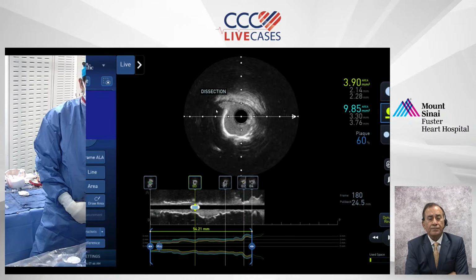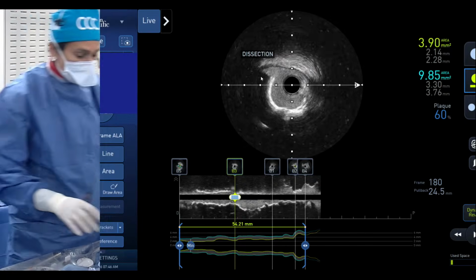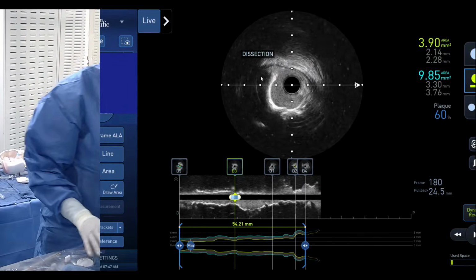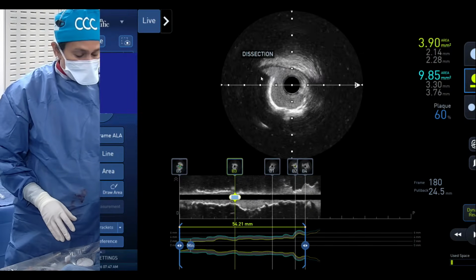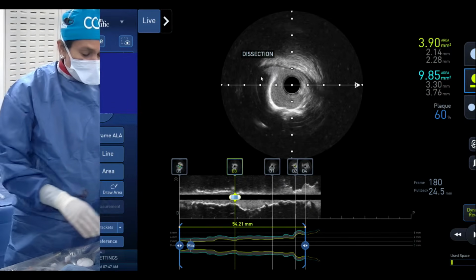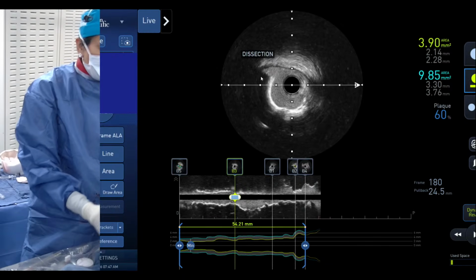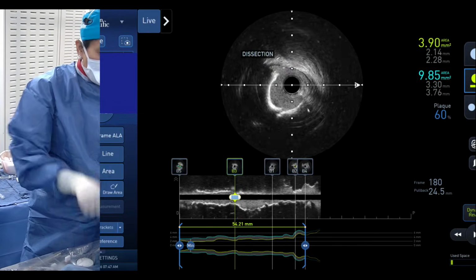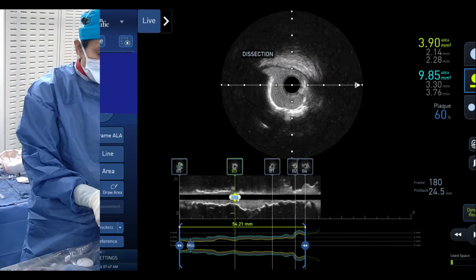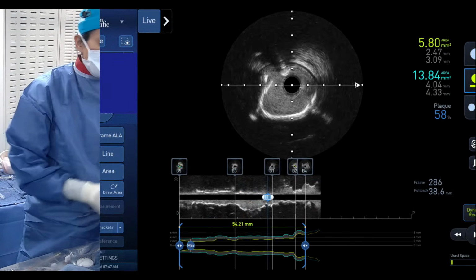So one point that we want to make, I don't know whether we have enough cases to come out with this algorithm, which we always try to say, which one you should use. Either an atherectomy device you have used, then do I use a cutting balloon? Do I use IVL? And if you are using IVL, what size IVL? The point is, I gave 3 pulses. Can I come out, or do I have to go back and finish all the pulses?